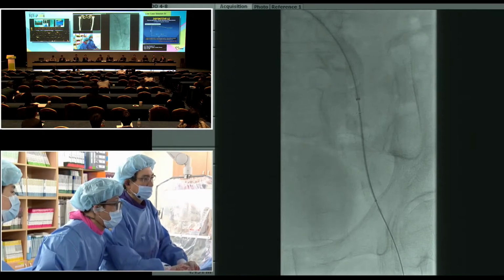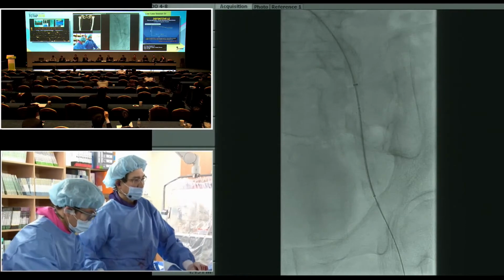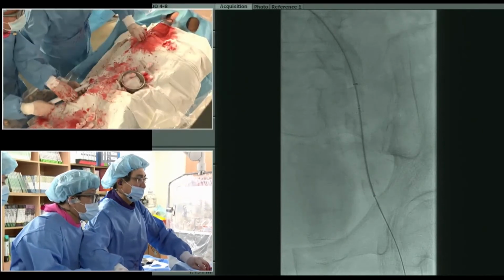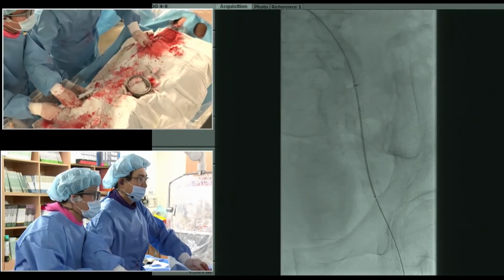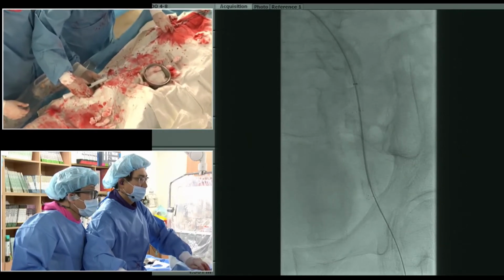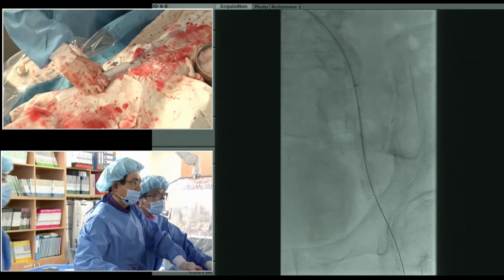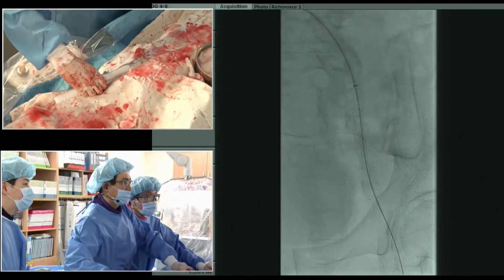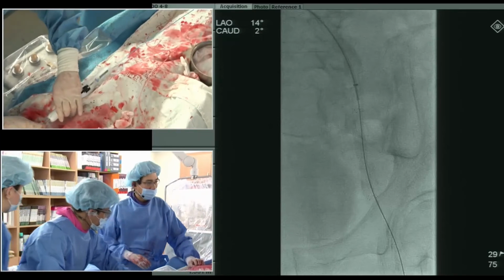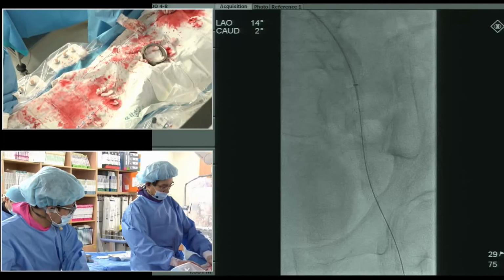A little bit short? Okay. A little bit. Let's go here. Okay, let's go. The proximal portion. No problem. Okay. And the 7mm balloon? Yeah, 40. Dr. Che, do you see the difference in stents for the different iliac regions?